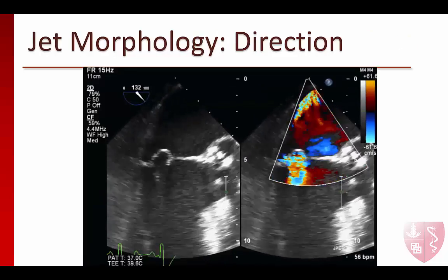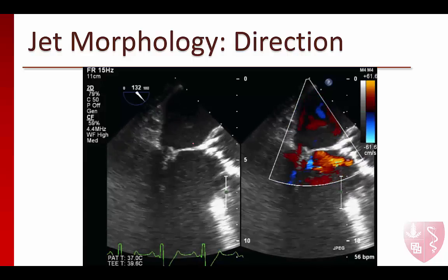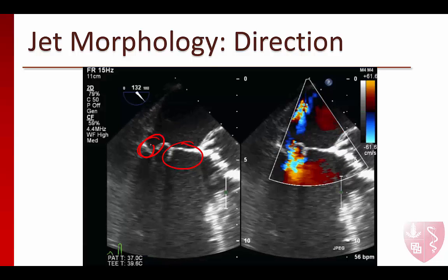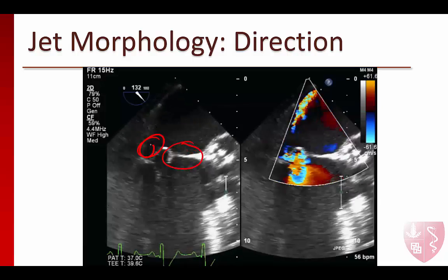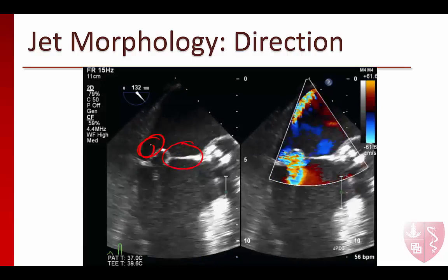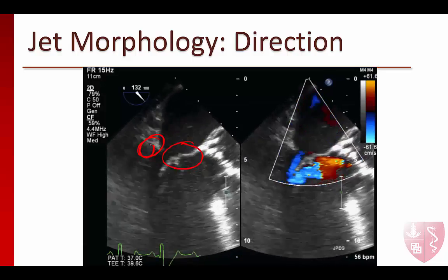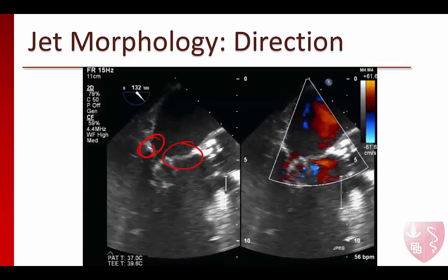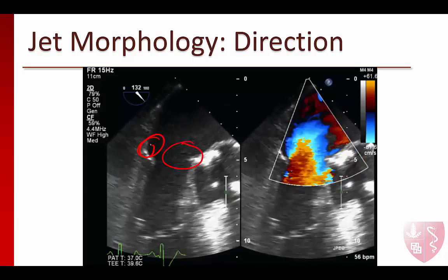This is a mid-esophageal long-axis view of the mitral valve. We are most likely seeing A2 here and P2 here. Notice that A2 is prolapsing into the left atrium, causing an eccentric jet of regurgitation that is directed away from the diseased leaflet. The regurgitation may not appear very severe at first, but notice the wall-hugging jet at the top of the screen. This is likely severe MR and is an example of Carpentier's type 2 disease.